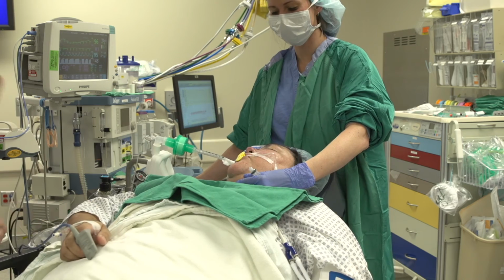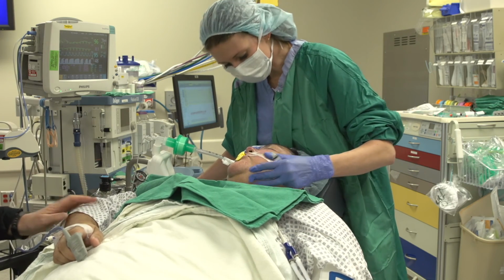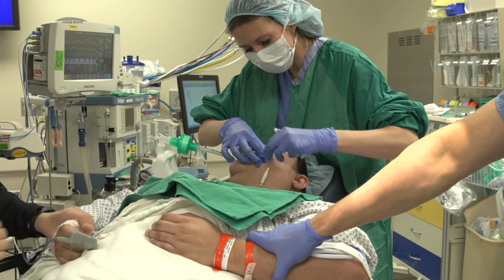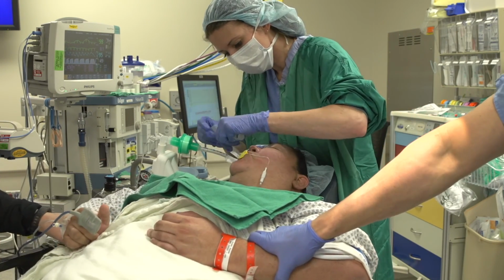ANEclear only removes volatile anesthetic. ANEclear will not alter the elimination rate of IV sedatives and opioids. Therefore, clinicians should manage their patients' IV sedatives and opioid levels accordingly to plan for emergence. Finally, monitor your patient for the classic signs of emergence from inhaled general anesthesia and extubate based on your best clinical judgment.